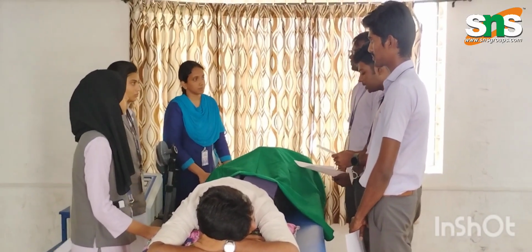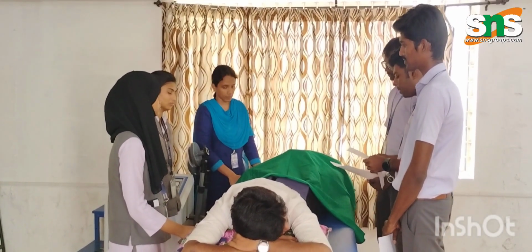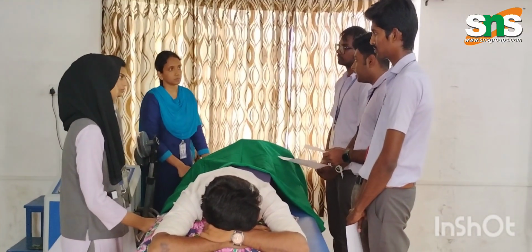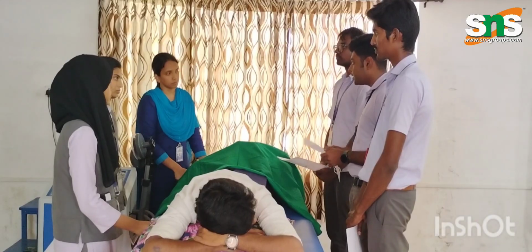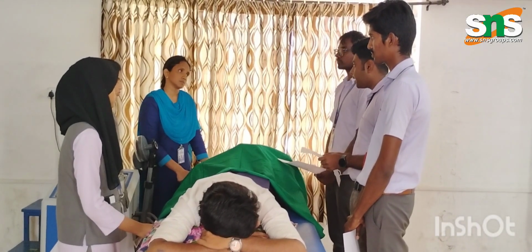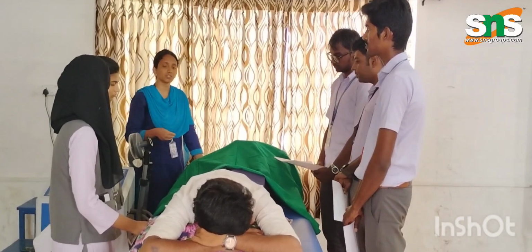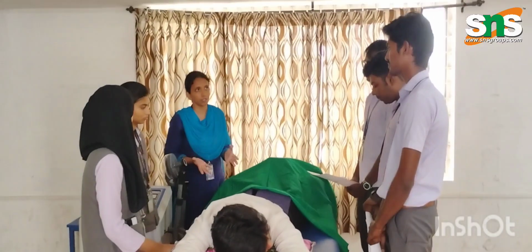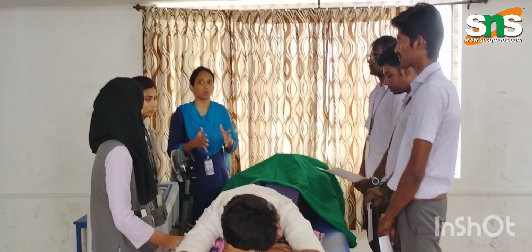Contraindications and safety measures. The contraindications are pacemakers, pregnancy (in the lumbar region), malignancy, metal in the treatment area, and active infection. The safety measures: the therapist should maintain a safe distance, regularly check the modality, and take patient feedback during the treatment. The patient should feel a mild warmth-like sensation, not a burning kind of heat, though no heat sensation at all is also not acceptable.